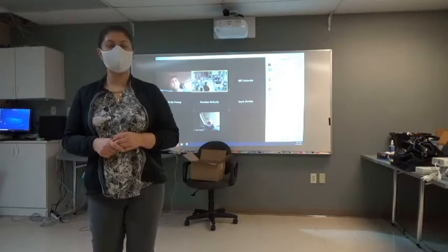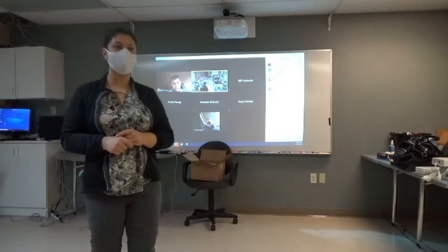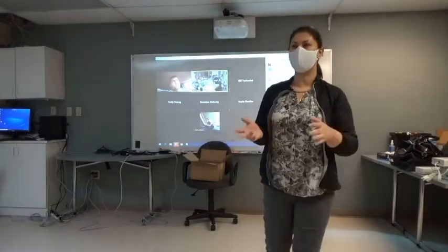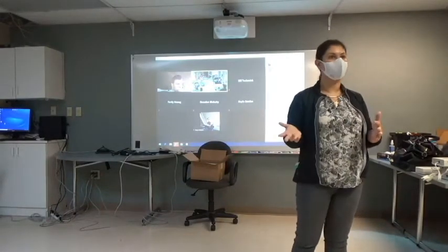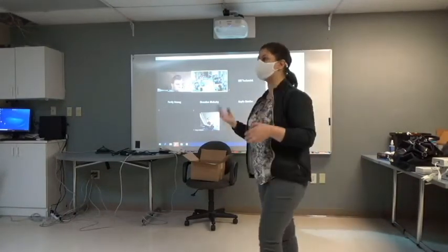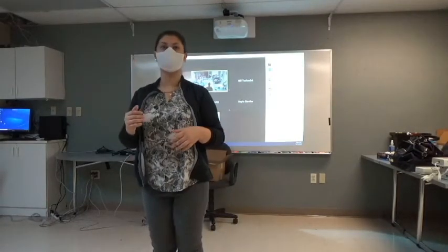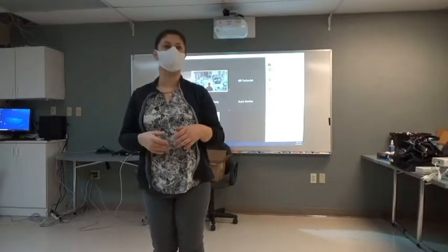Just below that, you guys are going to find your pulse ox. Your pulse ox is made by Masimo. A couple of things with your pulse ox. You have a couple of tools in your toolbox. Number one, you've got your oxygen saturation, and then below that number, when we go to turn these on, you guys will see what I'm talking about. Below that number, you're going to get carbon monoxide as well as something called perfusion index.